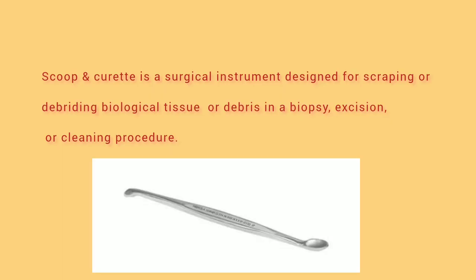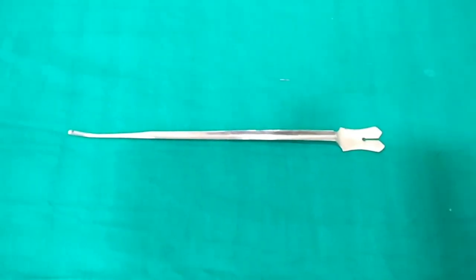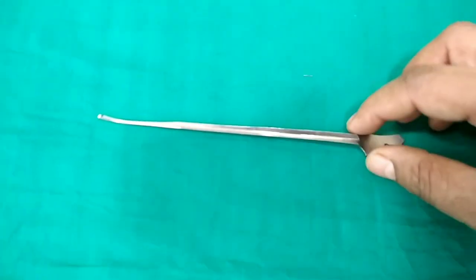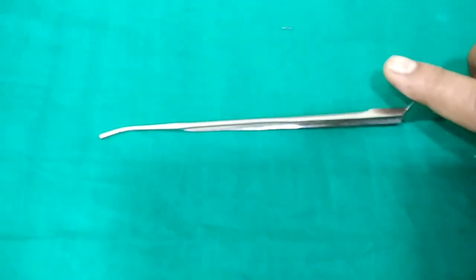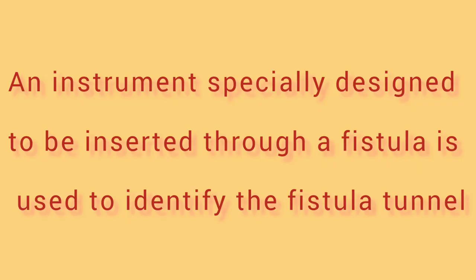This is a scoop and curette. It is used to debride or curette a wound or track. One end is for scooping purposes and the other end is for curetting. It can be used in D&C procedures, and also in fistula tracks for scooping or curetting purposes.